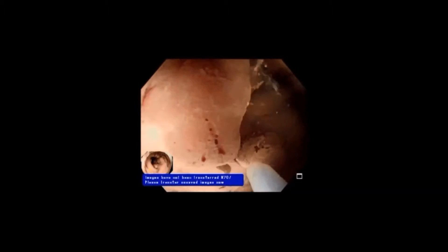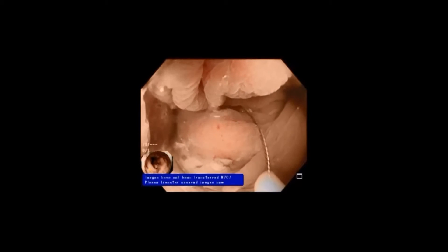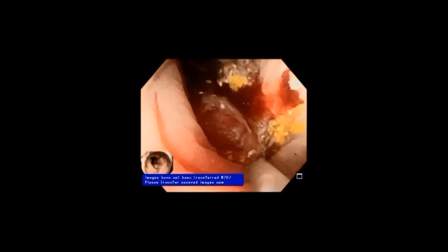APC works quite well underwater — you just march right up to the normal mucosa and tap it, and you'll get a nice well-defined APC mark. It works in the same way that your snare electrocautery works underwater. A lesion of this size we're going to remove in a number of pieces, probably 15 to 20, but I think the number of pieces is reduced compared to traditional submucosal injection EMR with gas insufflation because the lesion tends to stay smaller. So we're now cleaning up the edges as we get to the end of the procedure. We carefully inspect the perimeter of the lesion and the base and remove any residual tissue. There's a little red area that's actually a residual polyp, and the other red thing is a vessel. We go around the perimeter carefully, clean up the base, and then we've completed this underwater piecemeal EMR.